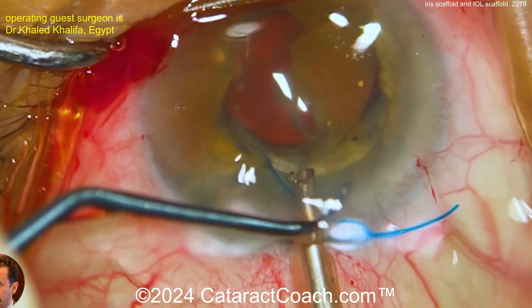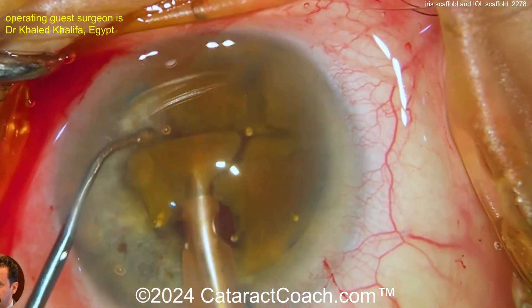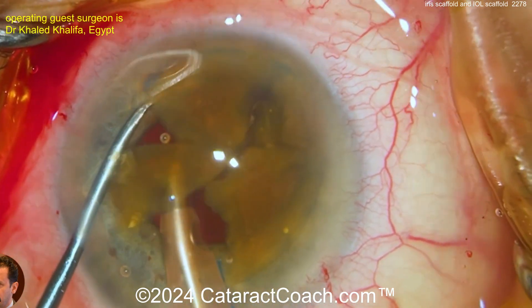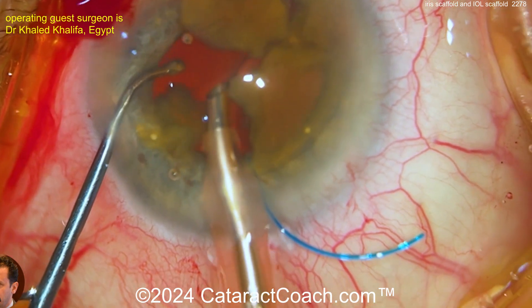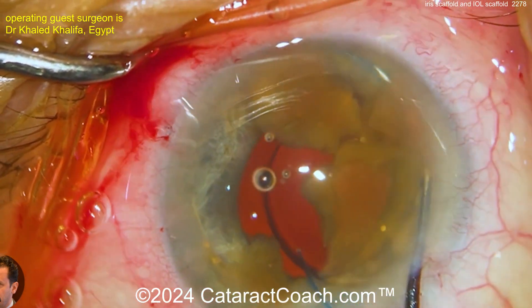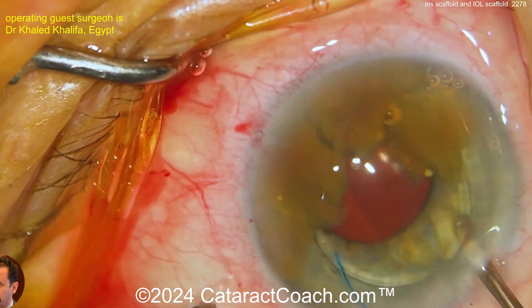Now when you use the phaco probe here, you better use easy settings — low flow. Like Osher taught us: go in there nice and easy, a little bit of buzzing at a time, don't go too crazy. Nice and slow flow, very low flow — maybe 10 cc's a minute at most, much less than normal. If the lens shifts, push it back and put more viscoelastic. Viscoelastic is your friend here.